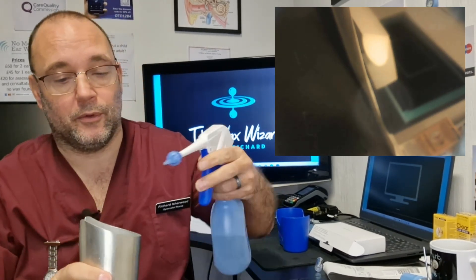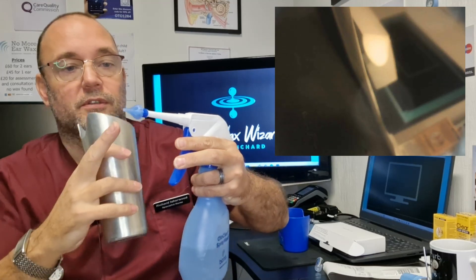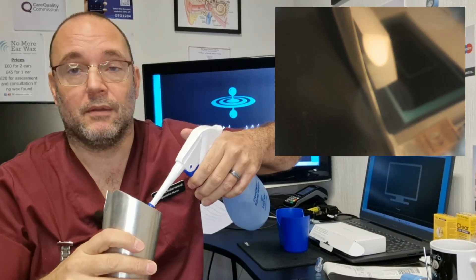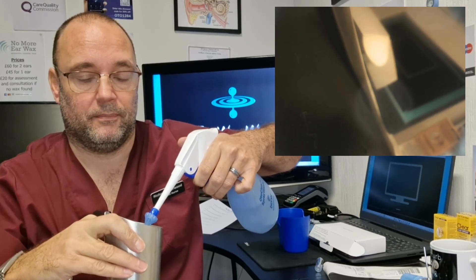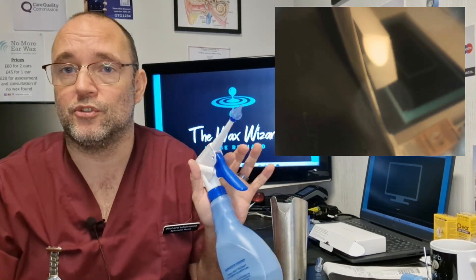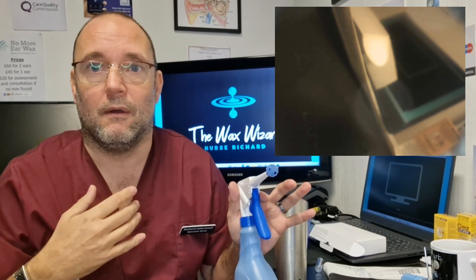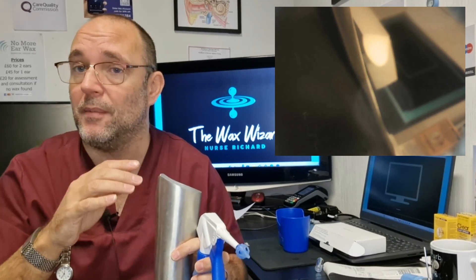Before we do that, you need to prime it and clear the line - the water sitting in the tube will have gone a bit colder, so you always need to get rid of that bit first, just get your finger underneath to make sure it's nice and warm again. There are a few conditions where you shouldn't use these: certainly if you've had a history of recent infections, a perforated eardrum, problems with fungal infections - there are lots of contraindications. But I know I've not got any, so I'm happy to do it myself.